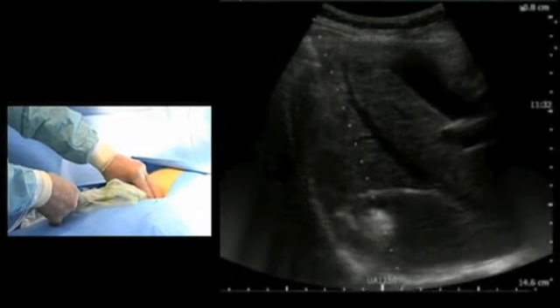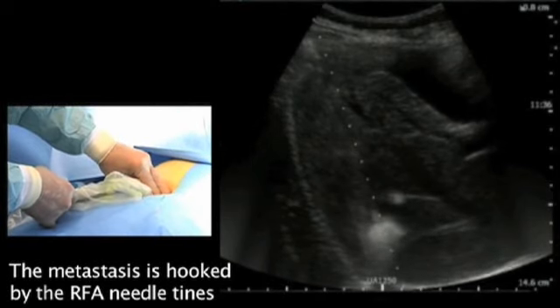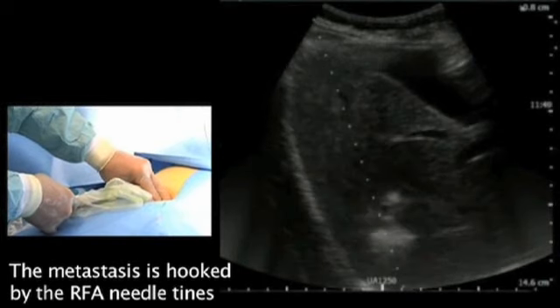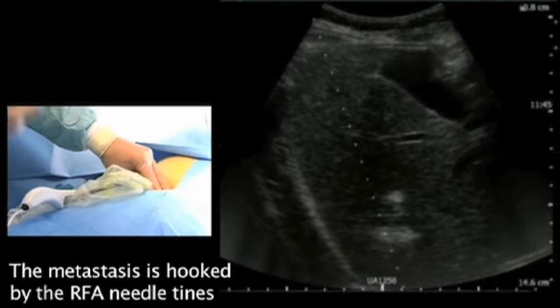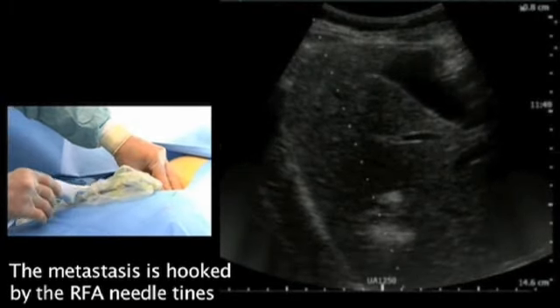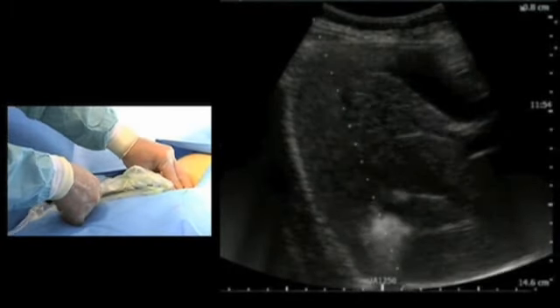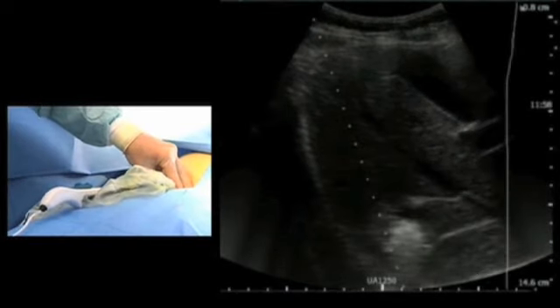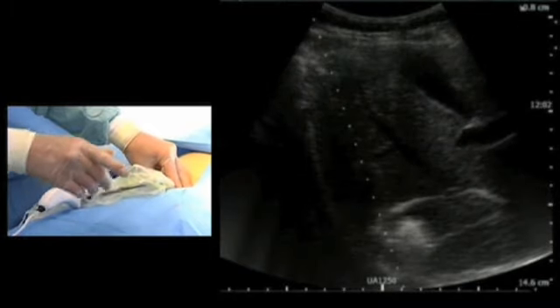We can also see the ultrasound image. When I'm moving the probe, I have hooked the whole metastasis, which is harder than the surrounding liver. So you can see the soft liver is actually moving up and down around this hard nodule, which has been speared by these tines here. So it looks good, and it's in a good position. The temperature is correct, and we will approach.